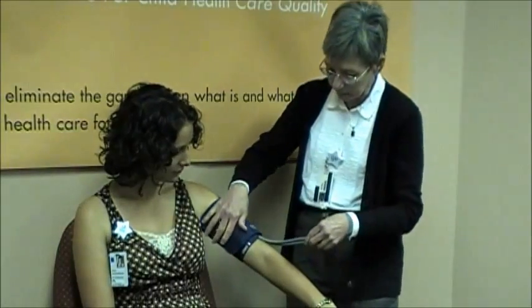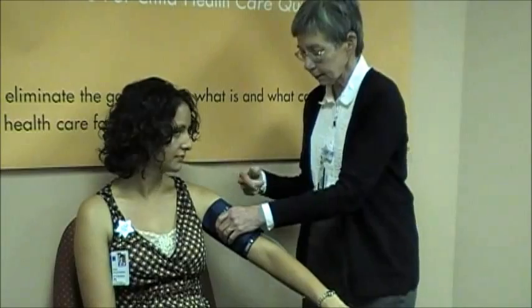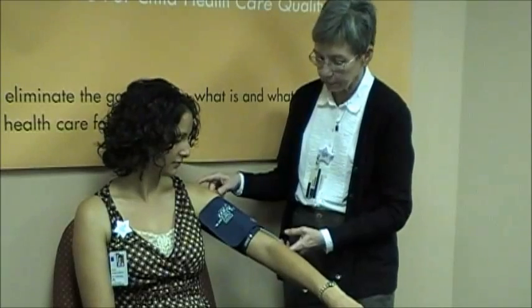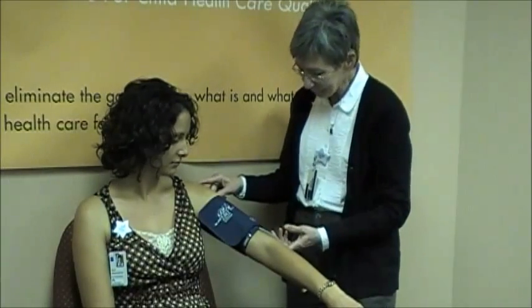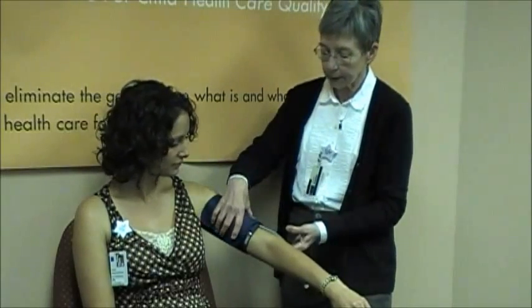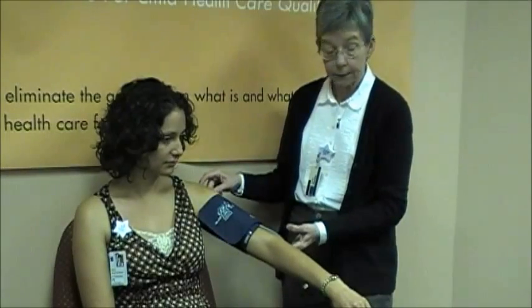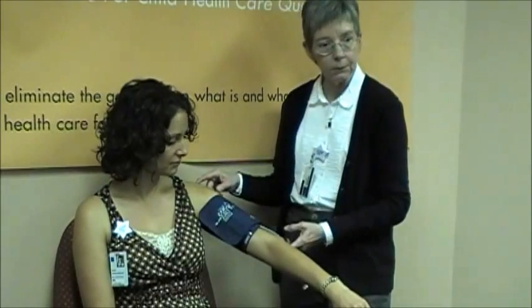The other comment about cuff sizes is that it's not just the cuff size around the circumference of the arm. It's the cuff size relative to the length of the arm from shoulder to elbow — acromion to olecranon. It should cover two-thirds, 70 percent, or 75 percent of that length. If you have a truly thin person who is very tall, sometimes even though the cuff seems to fit well around the arm, it may be too short and will still act like a tourniquet.